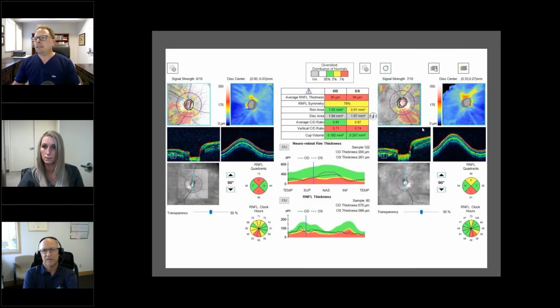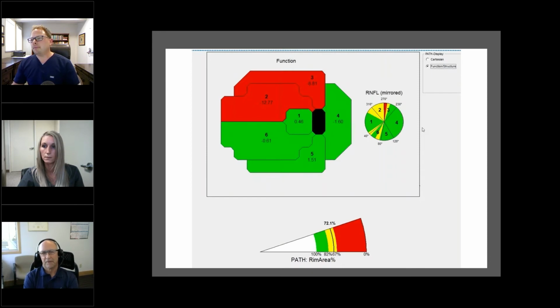Jim, question on that. Did you ever verify that path assessment versus what happens with the OCT, a few times, or? I did, and generally they're really, really close. In fact, I'll show an OCT on this patient, and it's never a dead ringer, but it is usually very, very close.